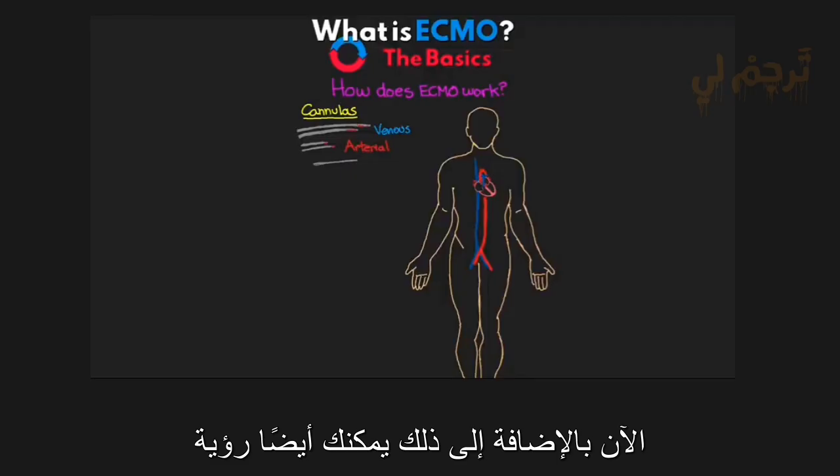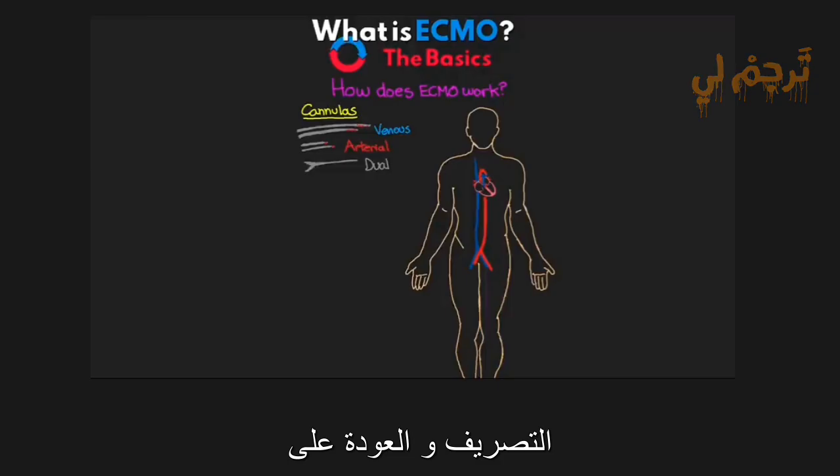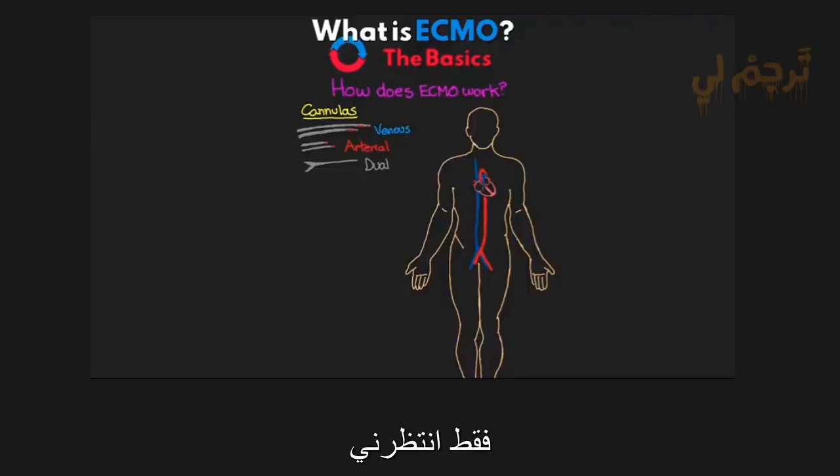Now, in addition to this, you can also see what we call dual lumen cannulas. This single cannula allows both the drainage and the return, specifically for when we have patients on VV ECMO. This is something I'm going to talk about here in just a little bit, so if you don't quite understand that, just hang tight with me.